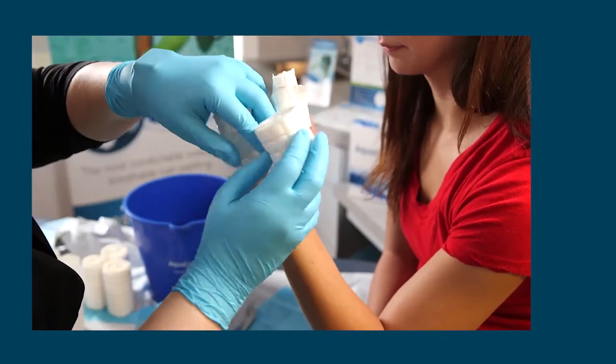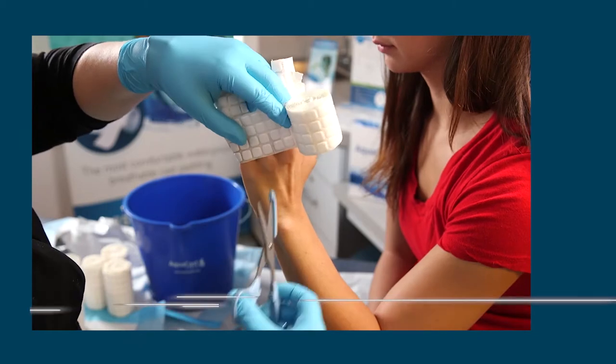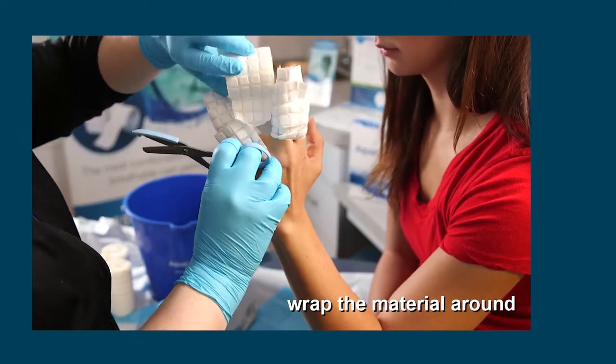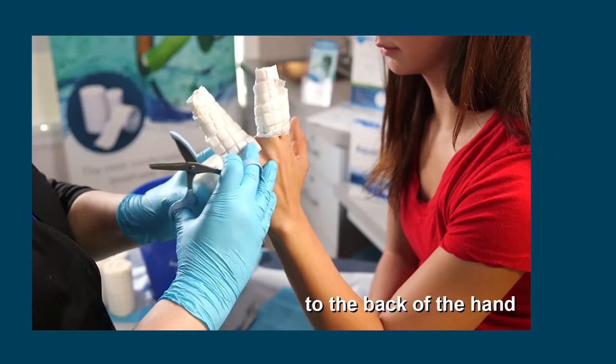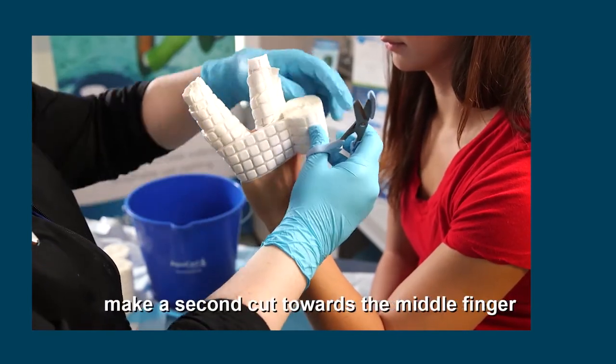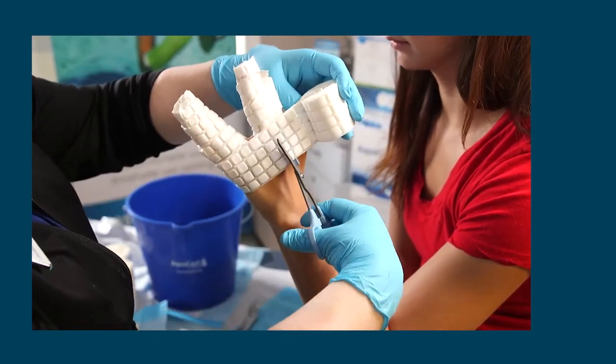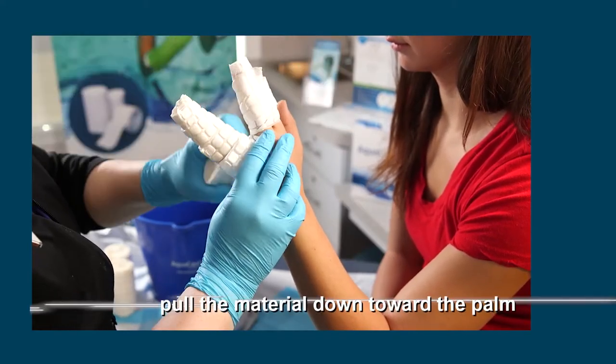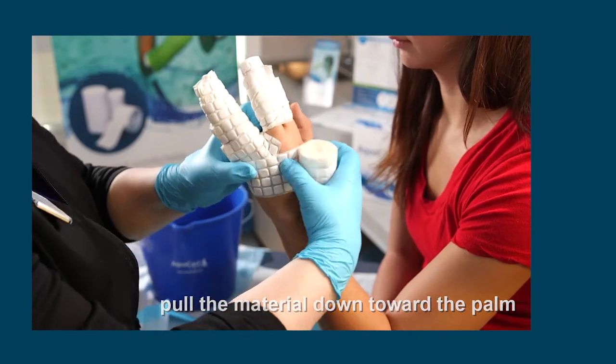To work through the web space between the fingers, make a small cut and wrap the material down and around to the back of the hand. Make a second cut towards the middle finger to allow for more coverage through the web space and pull the material down toward the palm of the hand.